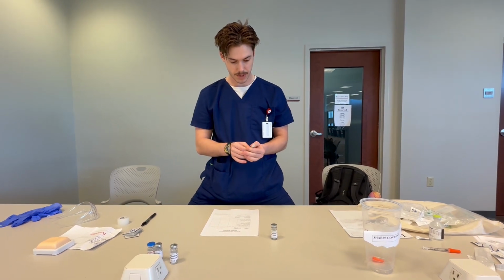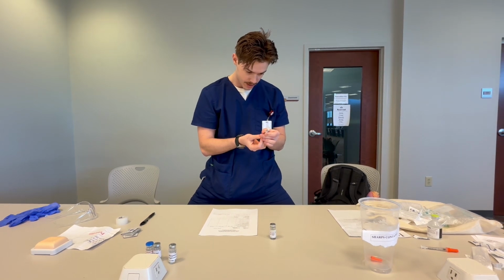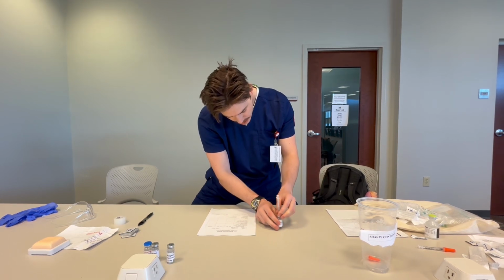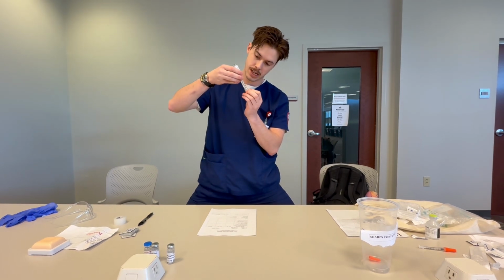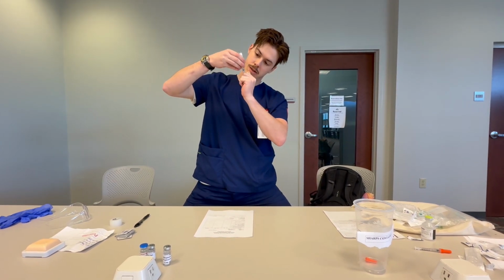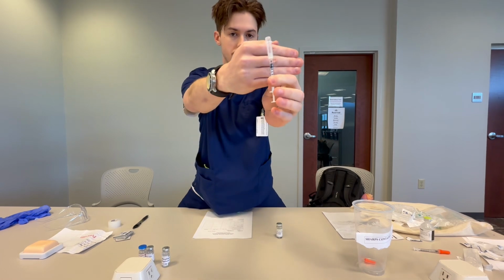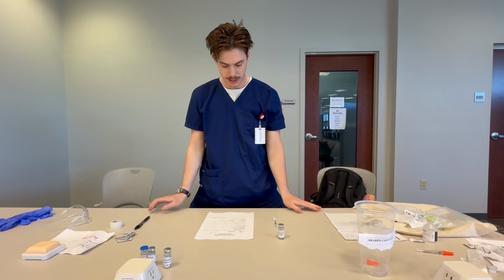All right, then I will take back the safety. I've already swabbed my medication. I will draw out 10 units of air and inject the air in. And flip. I will draw out 15 and then push back to 10. That is 10 units of Novolin R regular insulin.